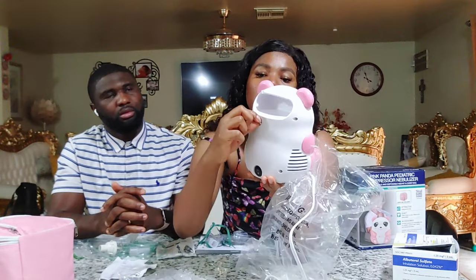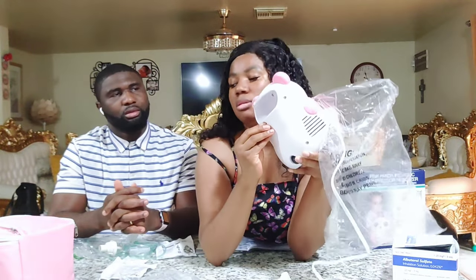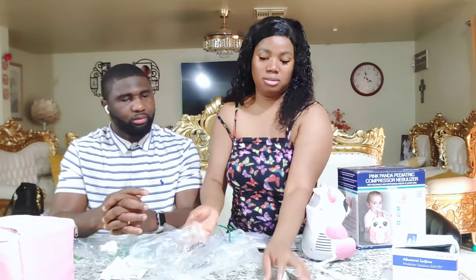Yeah, the filter. You gotta turn it counterclockwise and pull. And it says to replace every 6 months. Okay, every 6 months you replace it. So how do you get it replaced? You probably go to Drive, since this is Drive equipment. Okay. Go online to Drive and put in your part number and then get your filter. And whenever you get it, you put it back clockwise. So is the replacement going to be free or out of pocket? No, you purchase it. You have to buy it.